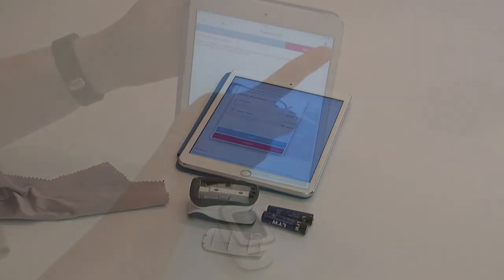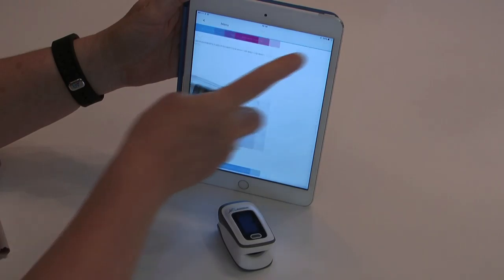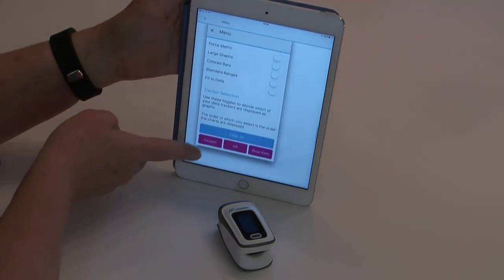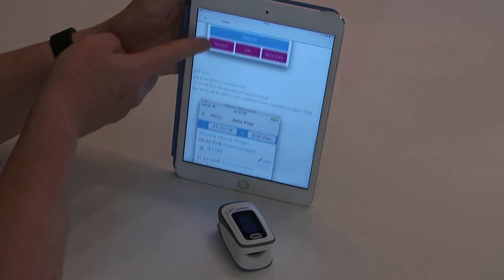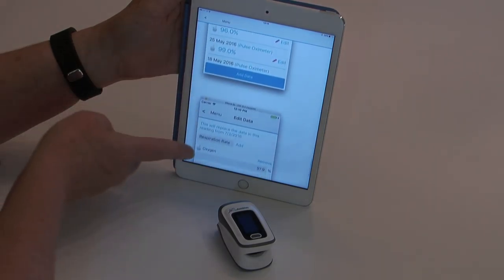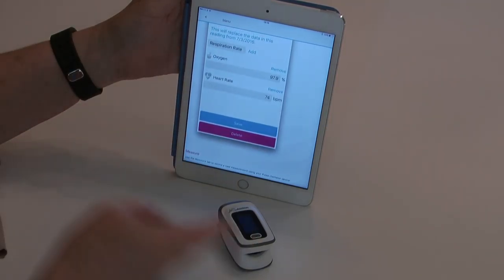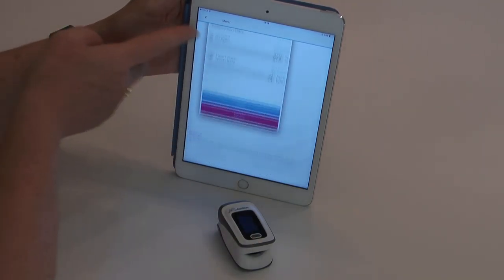For help and assistance, go to the app. In the top right-hand corner of the Pulse Oximeter 2 instructions page, there is a question mark. Touch that and it will expand to show you all sorts of information about how to use the device.